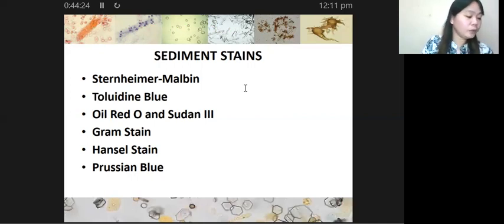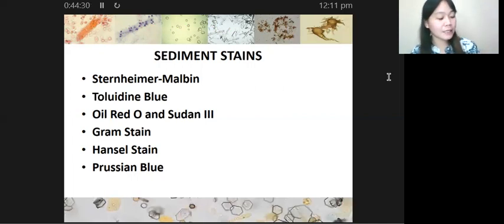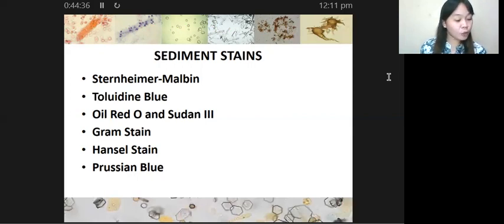Alright, so next we go to your sediment stains. Okay, so we go to your sediment stains. So there are, yes, there are 2, 4, 6 sediment stains that we can utilize in the laboratory.